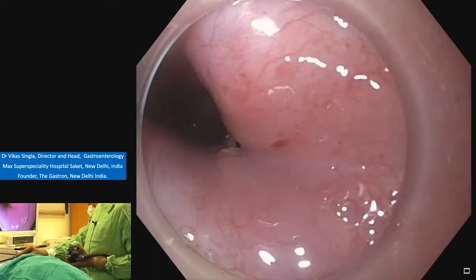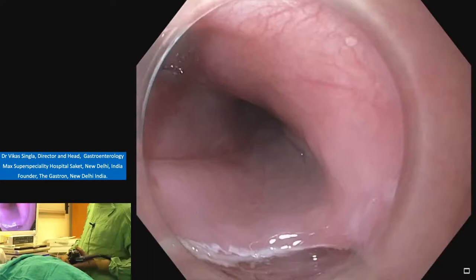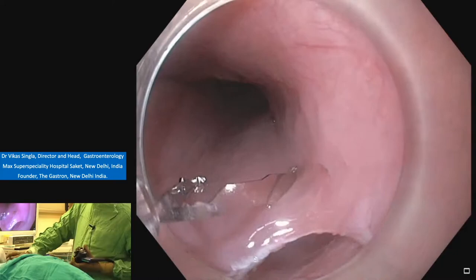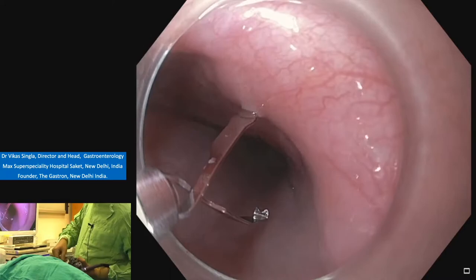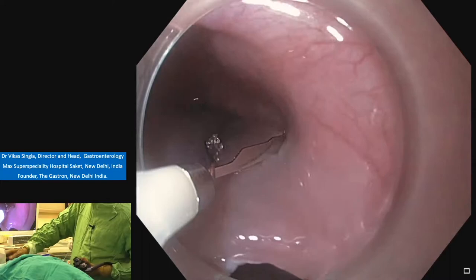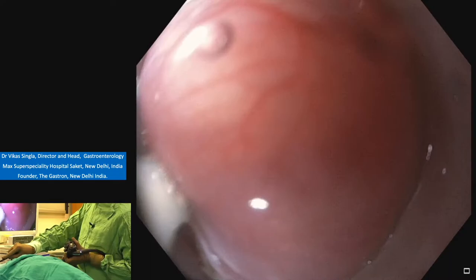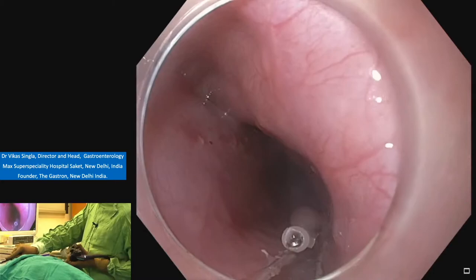Now we come to the last part, that is closure of the tunnel. The first clip should be most distal, distal to the incision. Open, and we should open, rotate, clip should be horizontal, and one should take both the margins equally. No, wait, press it down, suction, yes, fire. You see both the margins have been equally taken in the clip.